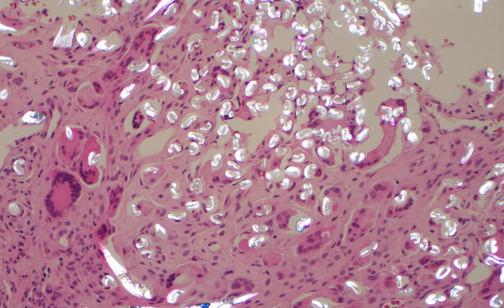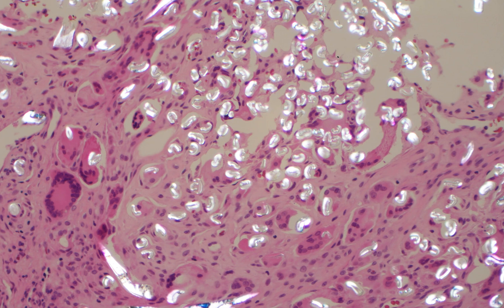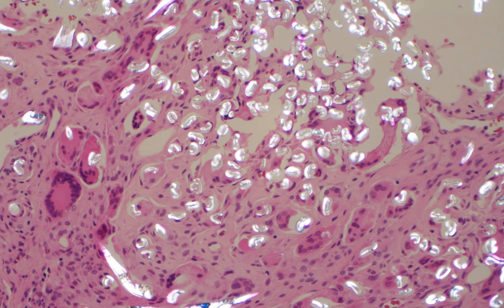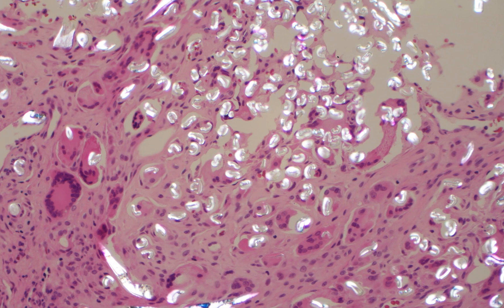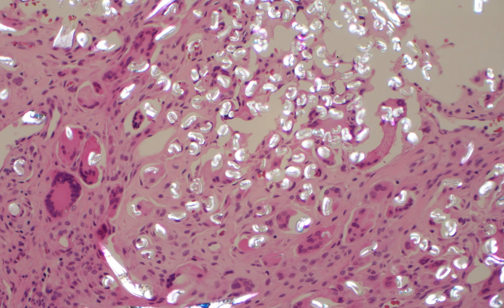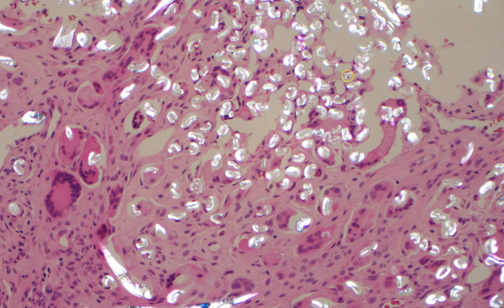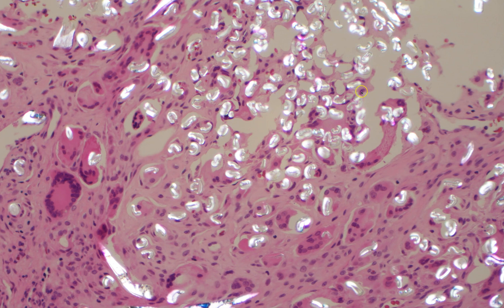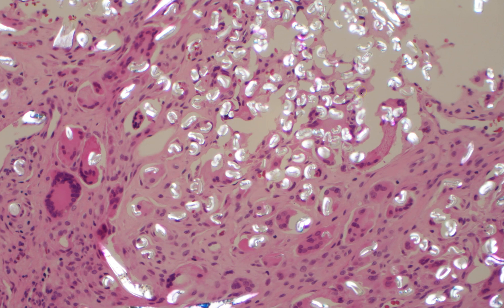The lessons here: this is what a foreign body granuloma looks like. Foreign body granulomas form in response to all sorts of different exogenous or foreign material in the body. Sometimes even material the body makes — like calcifications or keratin debris from a ruptured cyst or hair follicle — will produce a foreign body reaction, because once it's down in the dermis or soft tissue, the body doesn't like it. Don't be afraid to use your polarizer if you see giant cells and granulomas, especially near the skin. Finding foreign material can answer the question about what actually caused the case.